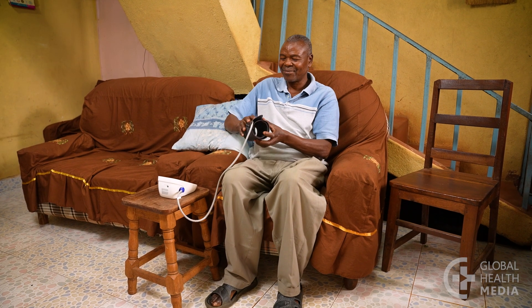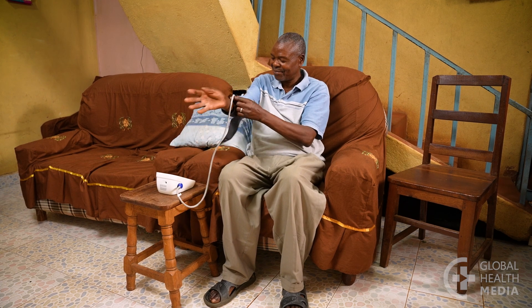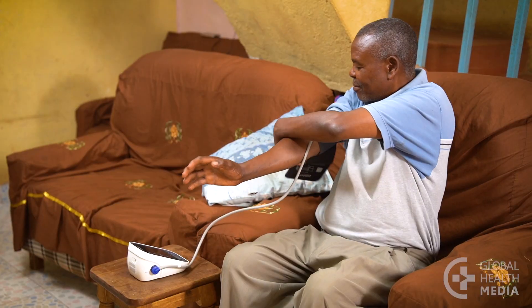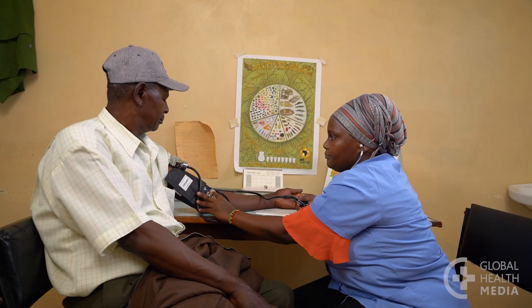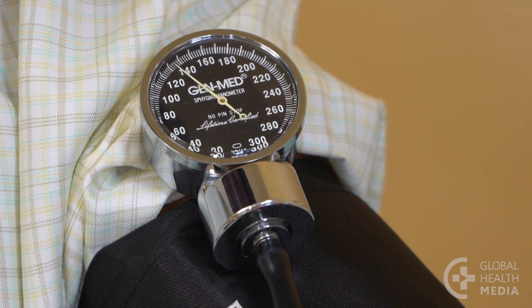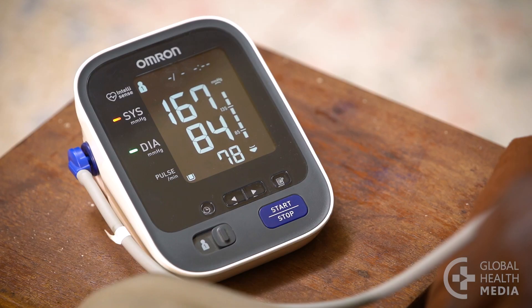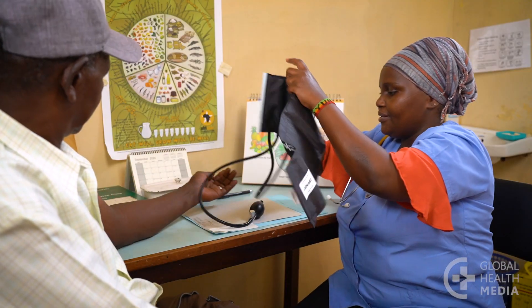Get a blood pressure device for the upper arm. If you can't afford to buy one, borrow one, or share one among a group of people. To check its accuracy, compare the reading taken by the health worker with the reading from your machine. It should be within 10 points, or check a list of validated blood pressure monitors online.